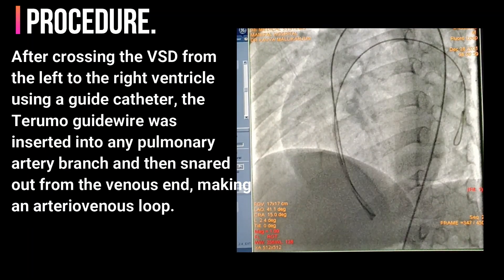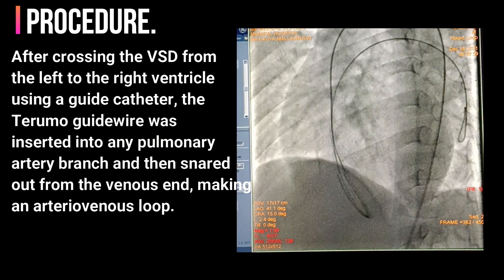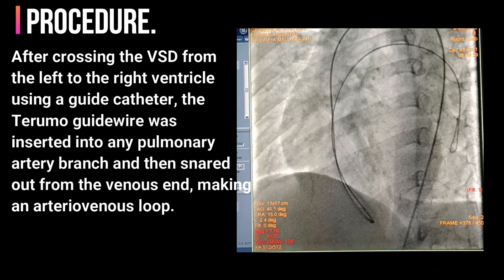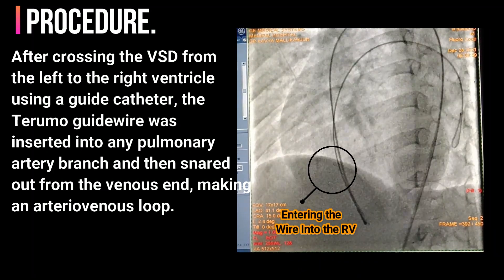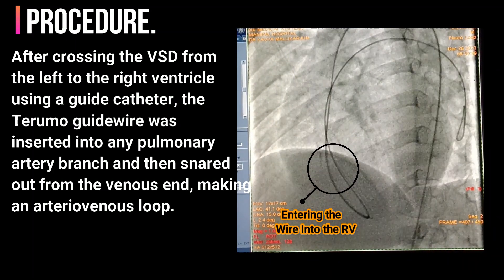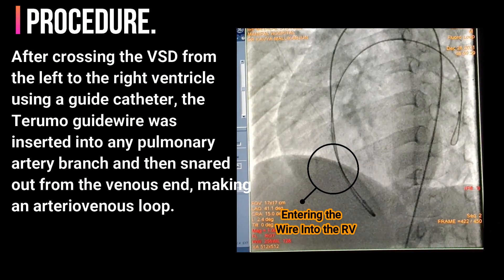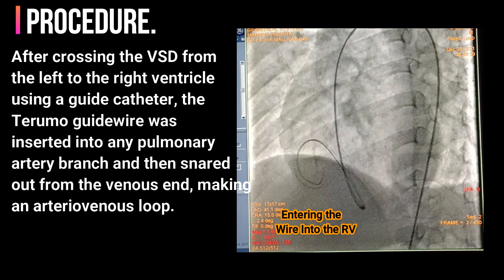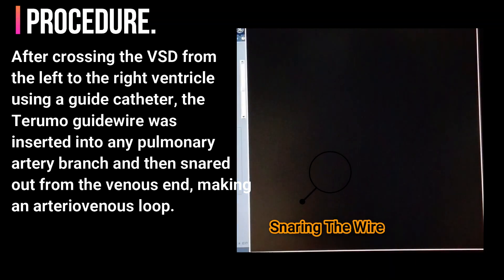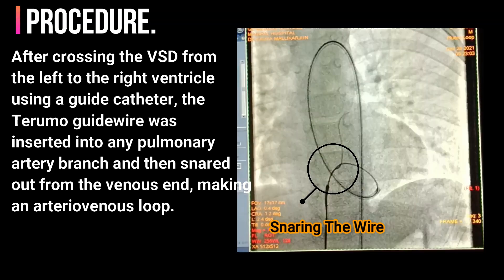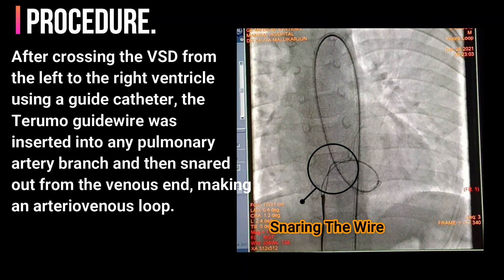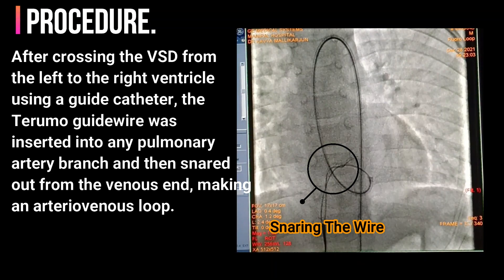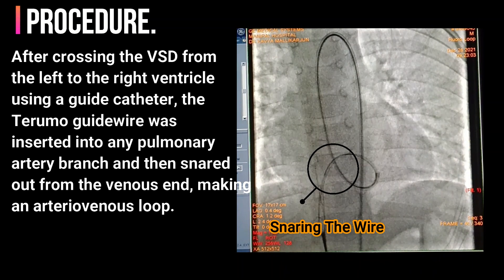In this case, after crossing the VSD from the left to the right ventricle using a guide catheter, the Terumo guidewire was inserted into a pulmonary artery branch and then snared out from the venous end, making an arteriovenous loop.